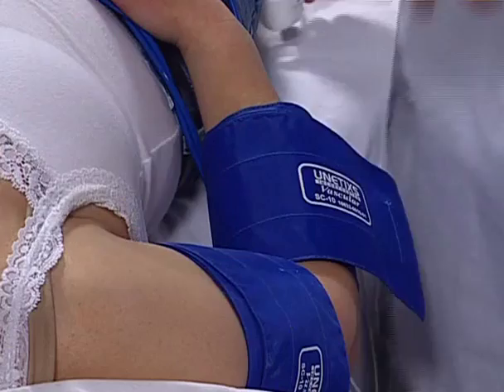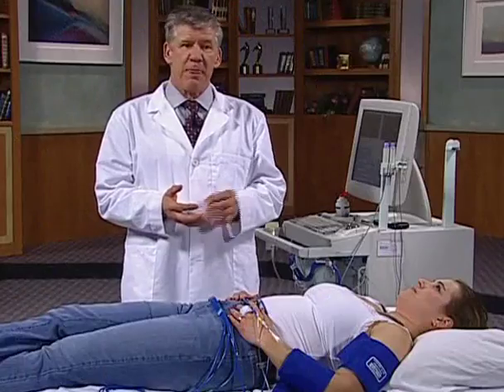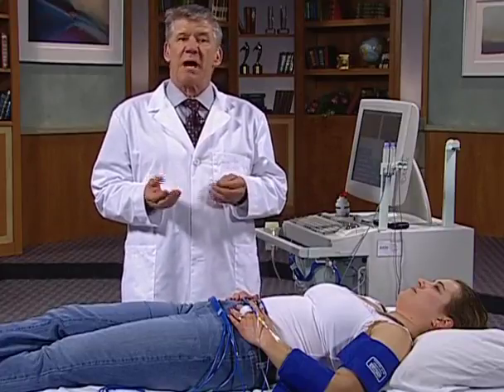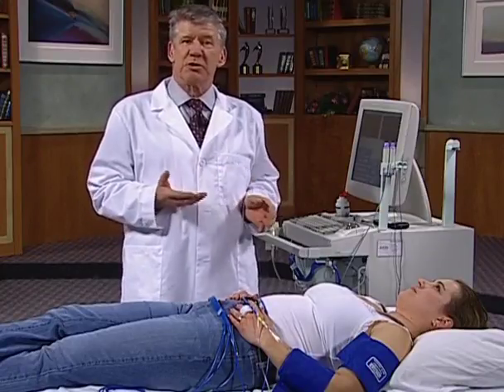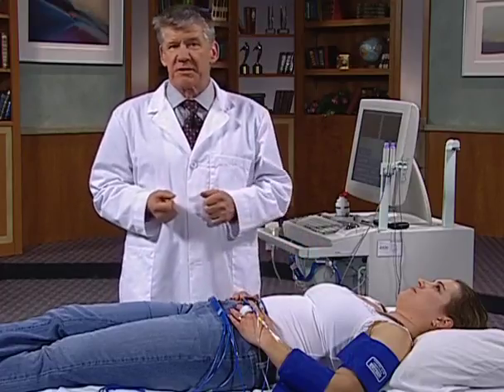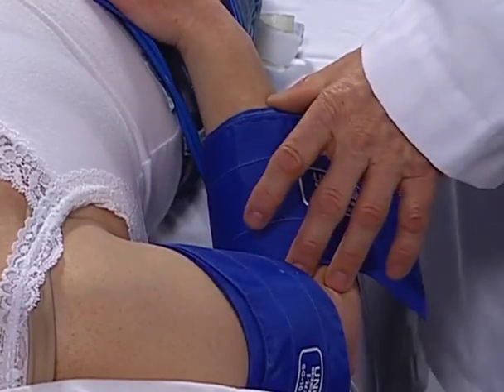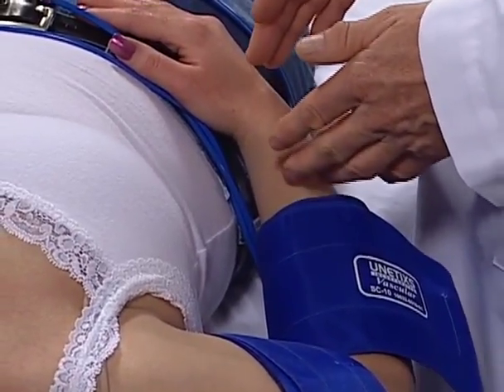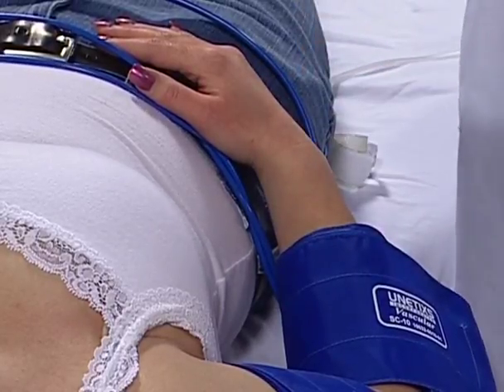It's very important. Now, I've already applied the blood pressure cuffs for this examination. We'll be performing pulse volume recording and obtaining blood pressures from the different sites of the cuff. We can also acquire Doppler waveforms from different sites along the arm. But for the purpose of this demonstration, we'll illustrate pulse volume recordings, or PVRs, as well as pressures from the different cuff sites. The cuff sizes are 10 centimeters on the upper arm, 10 centimeters on the forearm. We're going to just skip the wrist pressure for this demonstration, but normally we would use a metatarsal cuff or a pediatric cuff, and that's about a 7 centimeter size of the cuff.